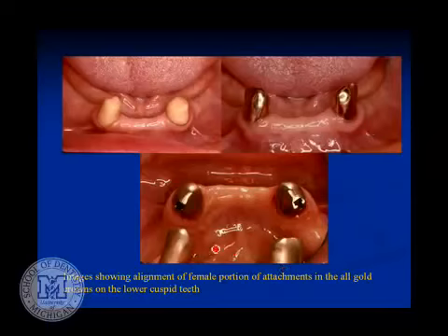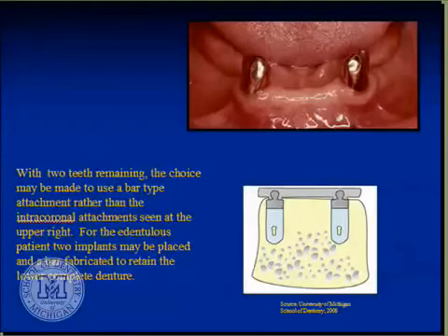So you prep the two teeth. You've got your two crowns done that have your attachments in them. That's an occlusal view to get a feeling for the fact that these things are lined up reasonably well so that they draw perfectly. Then we go ahead and make the partial. Now, if you've got basically two lower teeth, these teeth were not endodontically treated. These were vital teeth. We chose to do the conventional attachments.